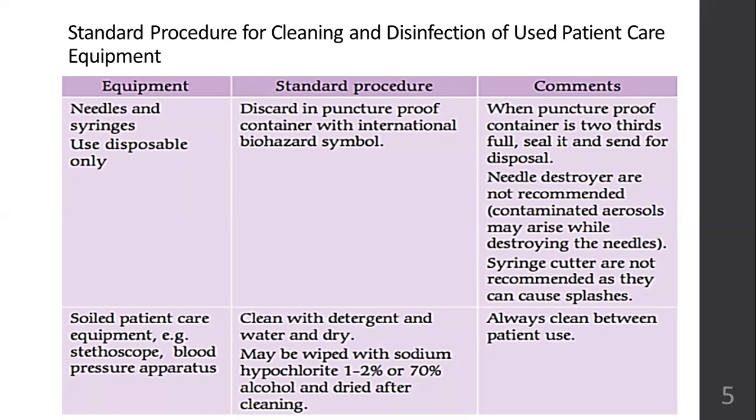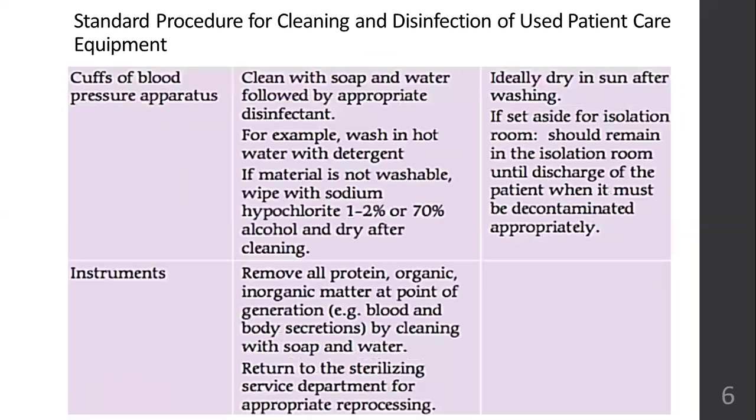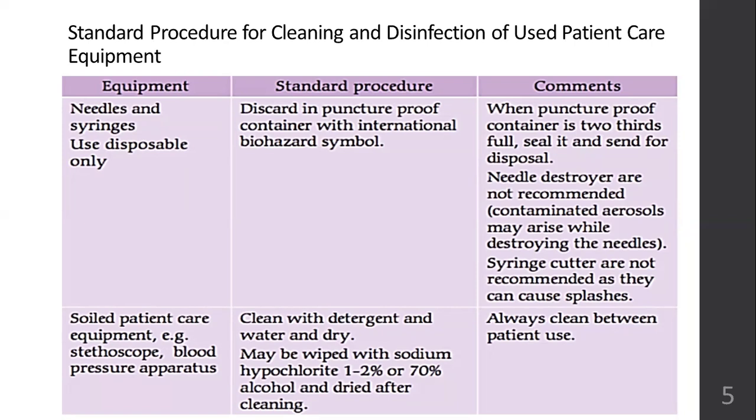Then patient care equipment like stethoscope, blood pressure apparatus, sphygmomanometer, the cleanable part of it, not the entirety of it. Okay, the cuff and all, that you can wash with detergent and water, or you can wipe it with a cotton swab which is dipped in spirit, or hypochlorite solution. Dry it and then you can use it. And between every patient use, you have to wipe it and then use it. Okay, between every patient use, it has to be done.